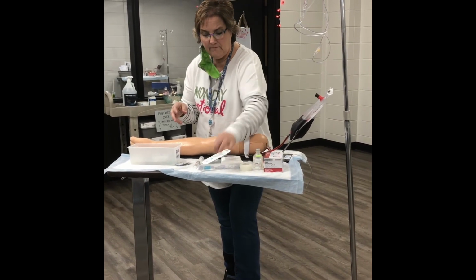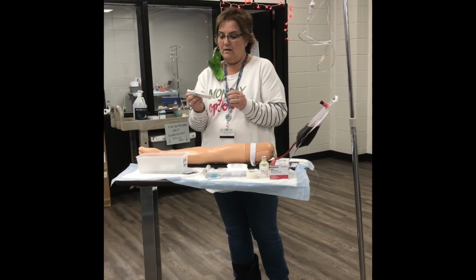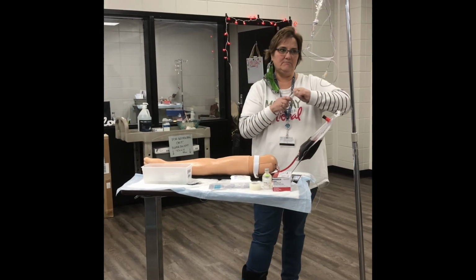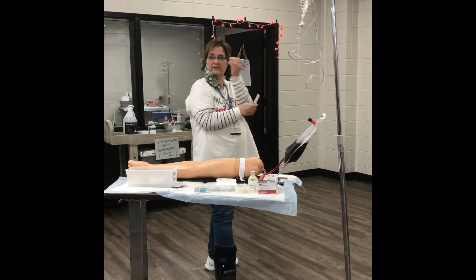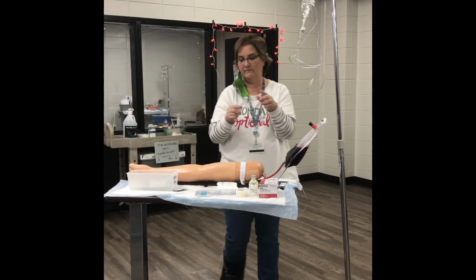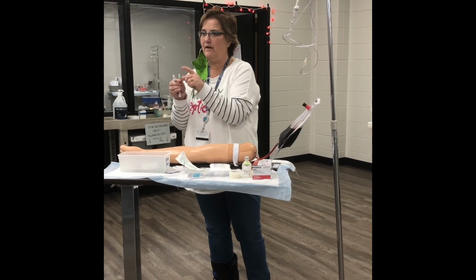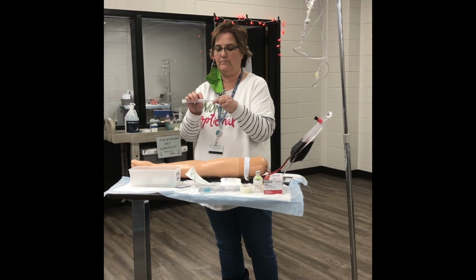All right, so first thing we're going to do though, before we get to the patient's room, is flush our INT line. We don't want that hooked up to my arm with air in it, right? All right, so I am going to, carefully, and I don't want to shoot any of y'all, I'm holding on to this where it's not going to get contaminated, but this is going to have air. You need to get all that air out first. All right, then we're going to open this up. Leave this cap on. You don't need to take it off. All right, this just pushes and turns.